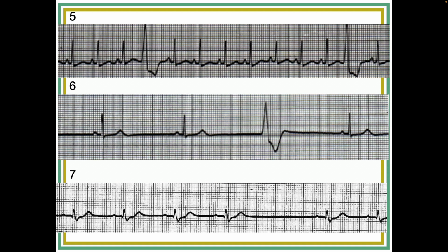But you're right. If you want the honest truth, it's hard to find an ECG strip with an escape. They're much rarer than premature beats, and so I sort of stick that one in, and nobody notices all this stuff. But you guys did great. It's right. So I would call that a sinus brady with an escape. Okay, any questions about that? Did we get everything answered that needed to be answered?